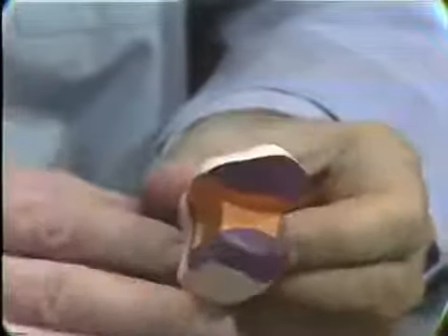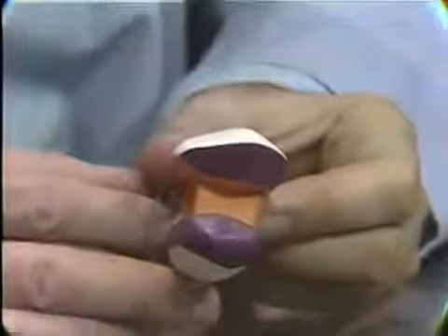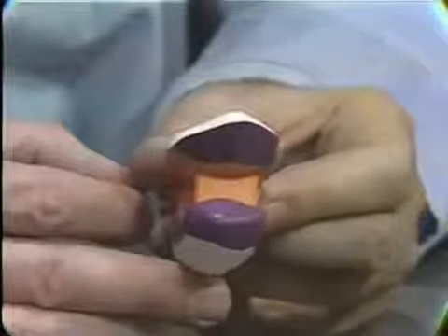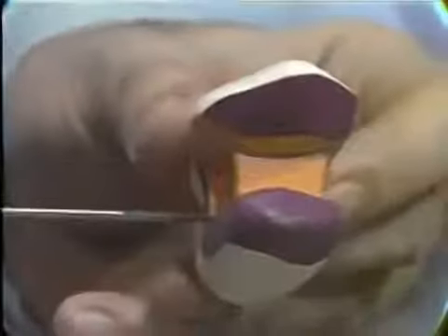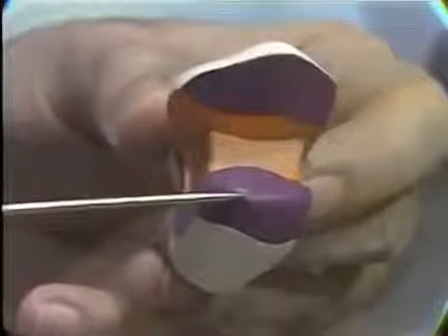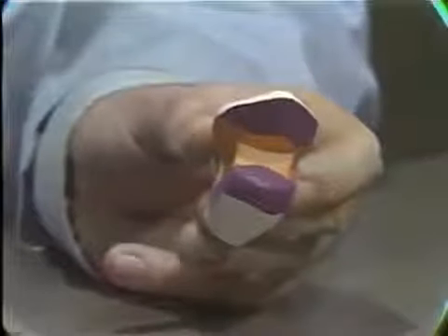And this then is something that you would use in a tooth that had previous restorations, an MO, a DO, or an MOD amalgam or inlay. This would be the means of converting it to a bridge retainer with minimum extra cutting of the tooth substance. It's possible in these situations, if necessary, of course, to place additional retention by means of pins, and these can be placed down in the cervical, perhaps one on either side here, or they can be placed in the tips of the buccal cusp if due regard is given to the position of the pulp chamber, and these will give additional retention in this type of situation.